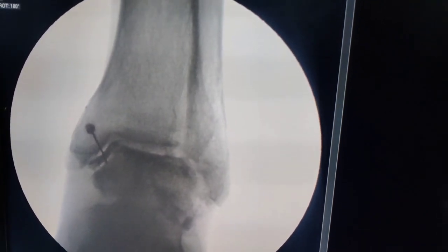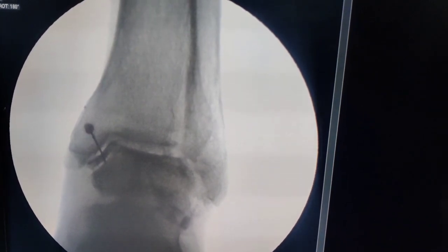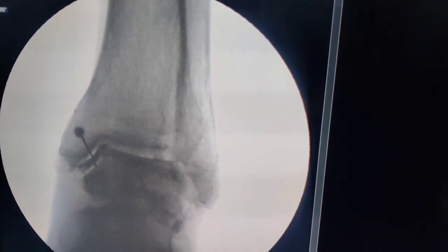Now if you look, our ankle joint is nicely seen — you can see the dye going from here and flowing on to there. That confirms our position. Our next step will be to aspirate this dye, because the ankle joint is quite small, so try to aspirate as much dye as possible and then inject our steroid.